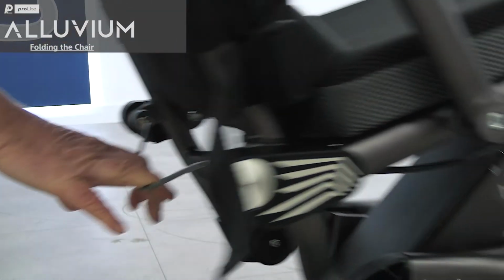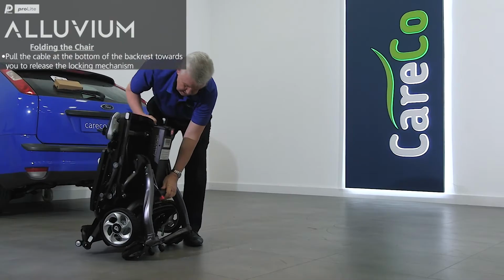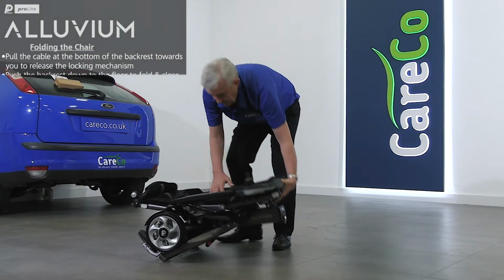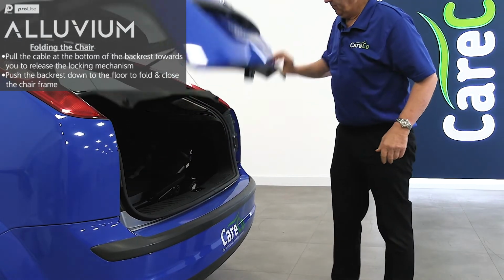To fold the chair away, pull the cable at the bottom of the backrest towards you to release the locking mechanism. And finally, push the backrest down to the floor. The Alluvium can now be pulled along and stored away.